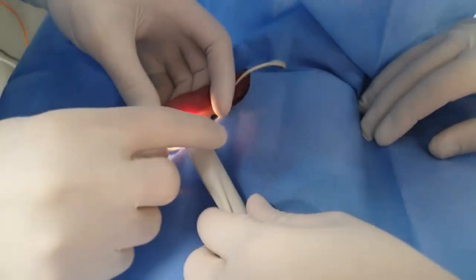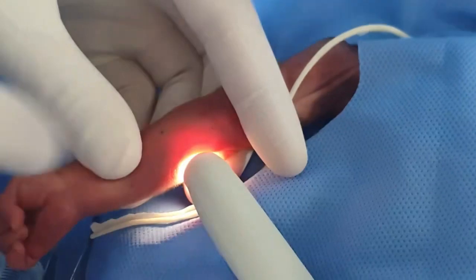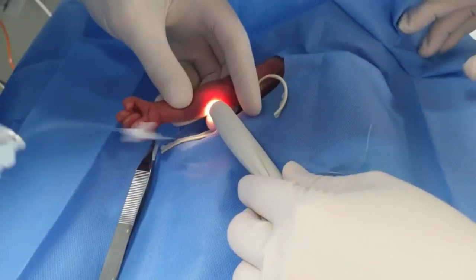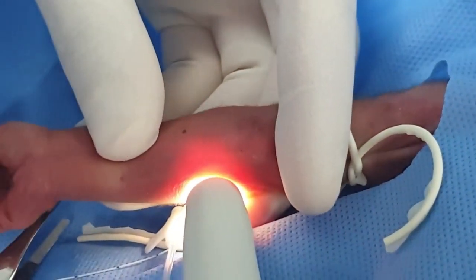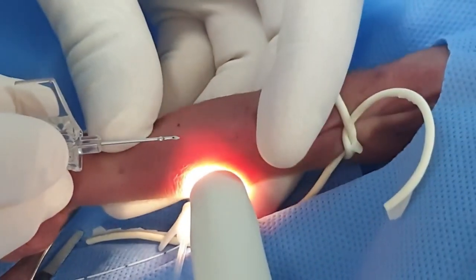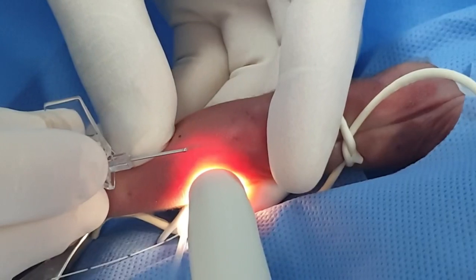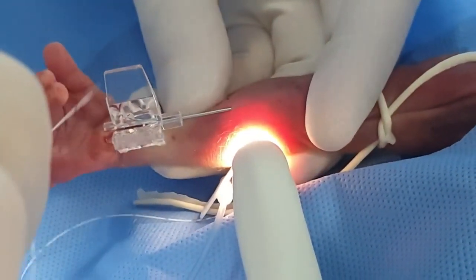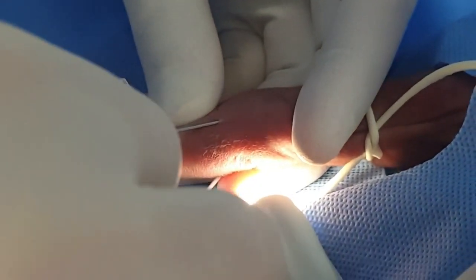We put the transilluminator here. You can see there are two tributaries. We are going to choose one of them and go inside. Here is the needle. We will position the catheter so it can easily go inside the needle. The first sign that we are in the vein using transillumination is that the vein will disappear. We put the handle down, and then we start to introduce the catheter.